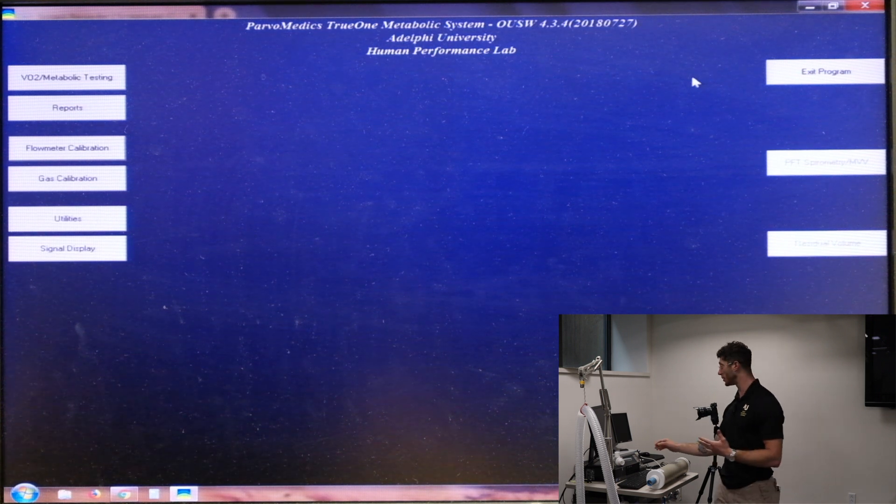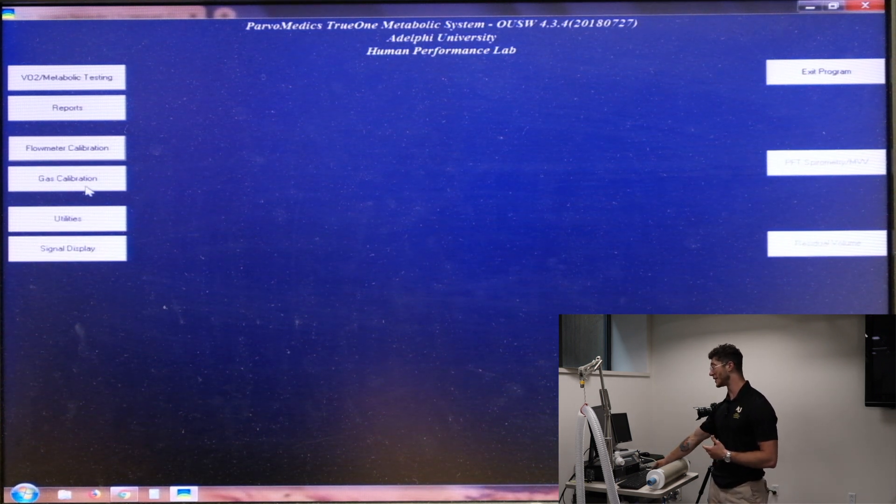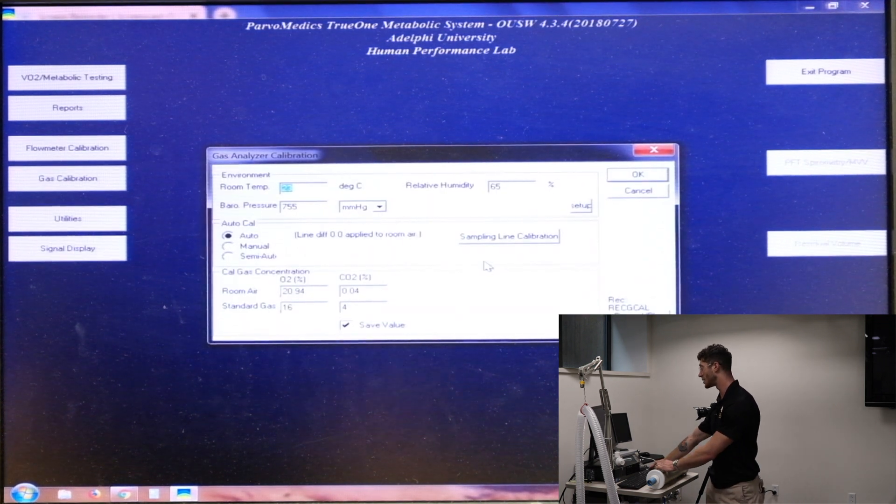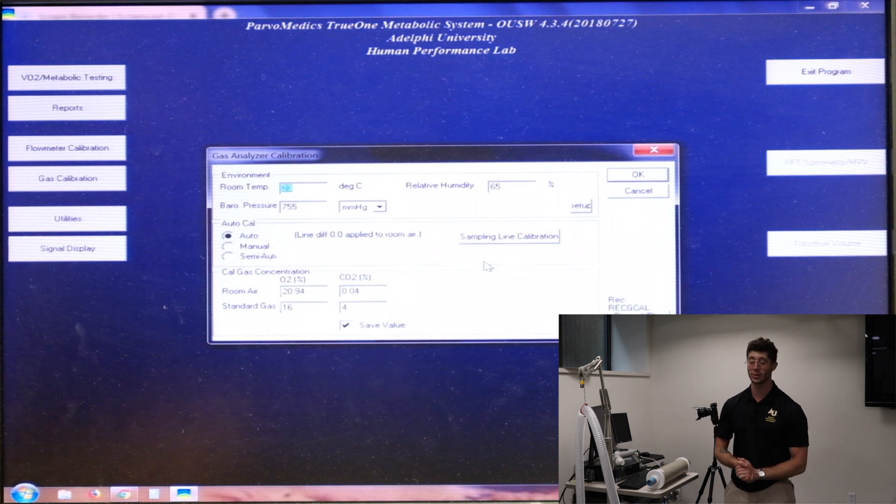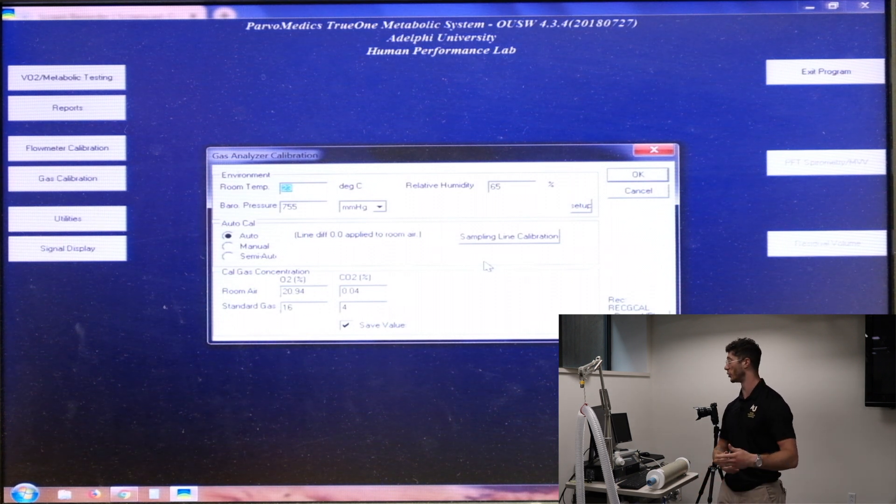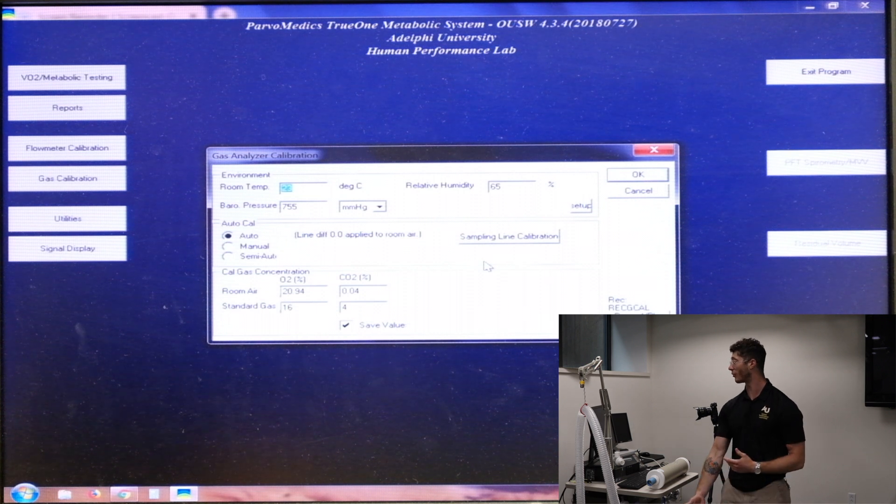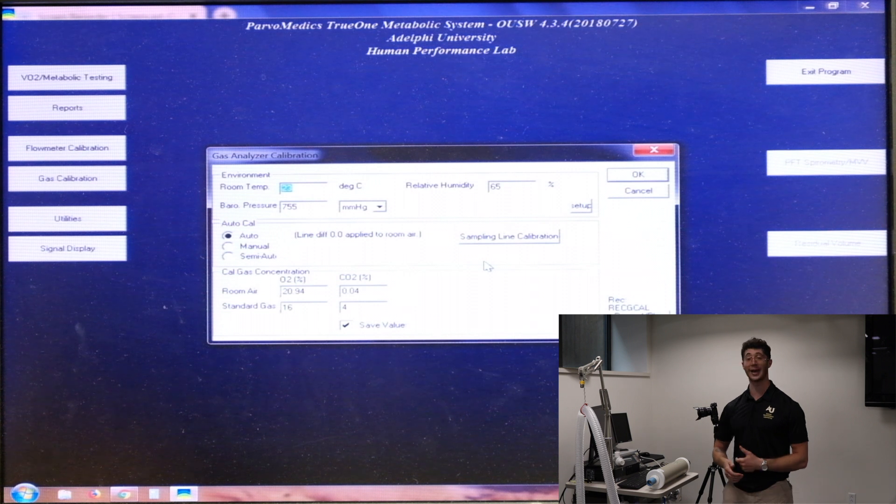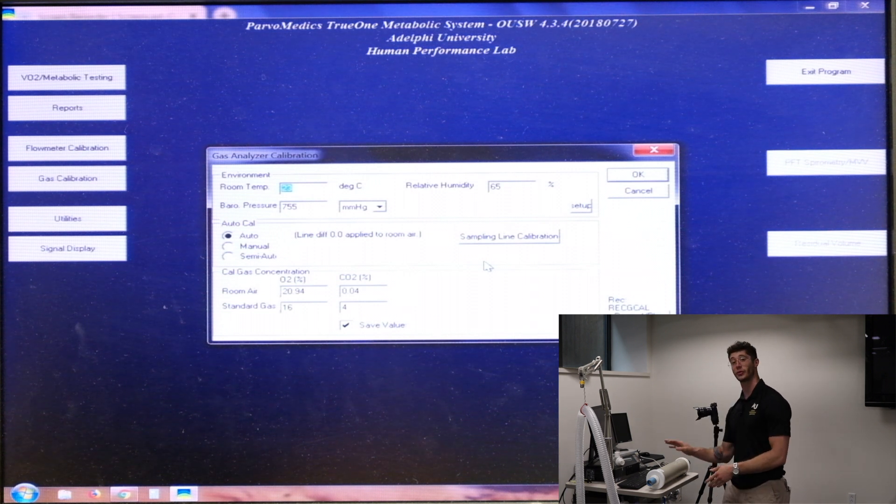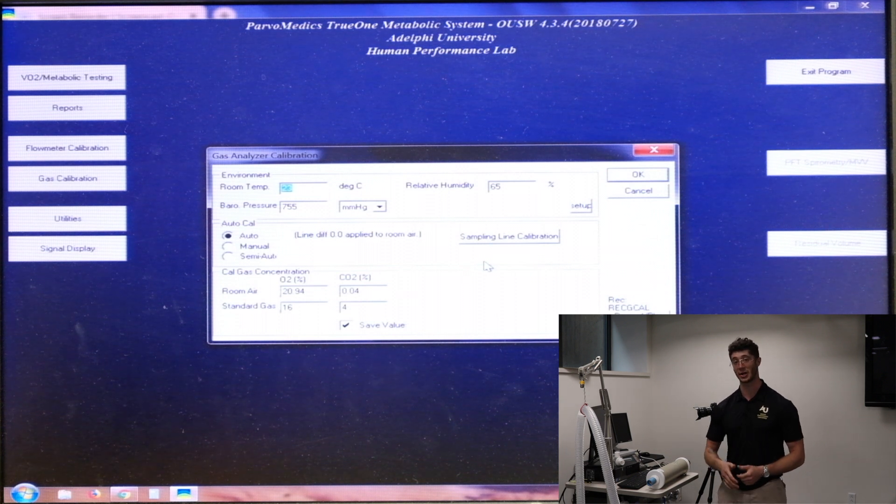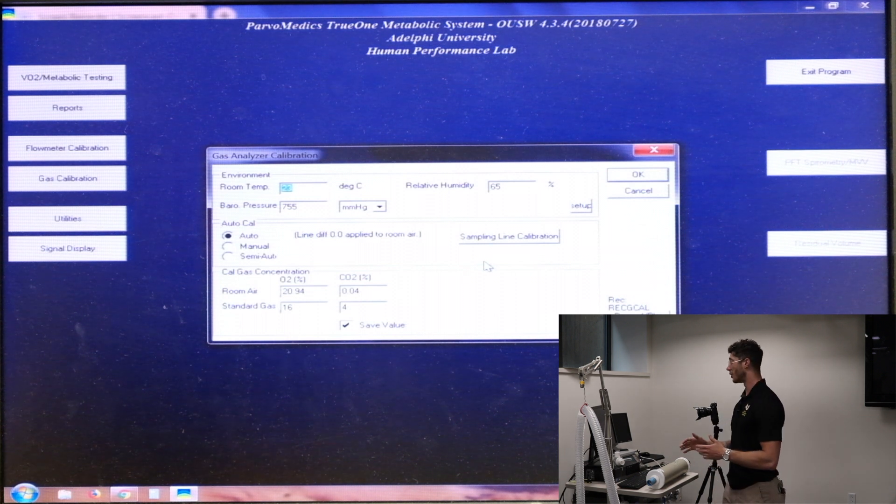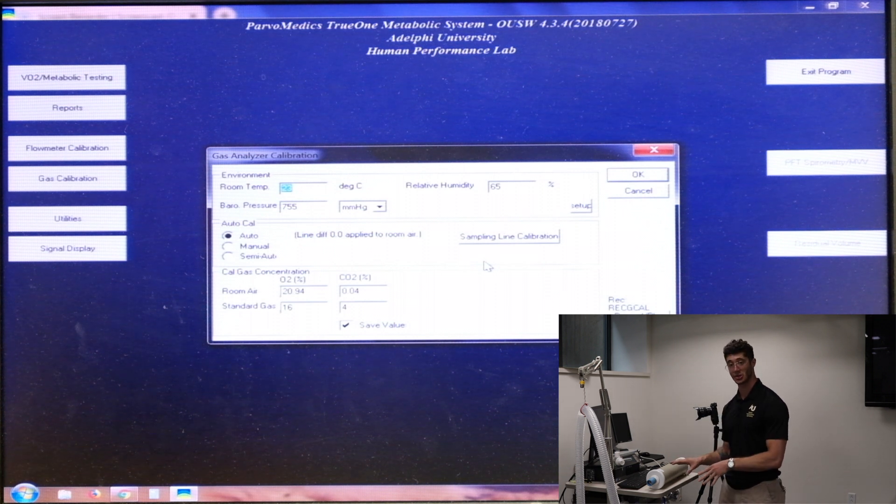The first thing that we'll be doing if we come over to the computer here is the gas calibration. So we'll click on gas calibration on the left and it's going to ask us for some environmental variables. So we've got room temperature, barometric pressure, relative humidity, and then it also asks us what the calibration gas concentration is. So we've got a canister of gas over here on the side of the unit and it has 16% oxygen and 4% carbon dioxide in it. This is how we are going to measure any discrepancies in the sensor.